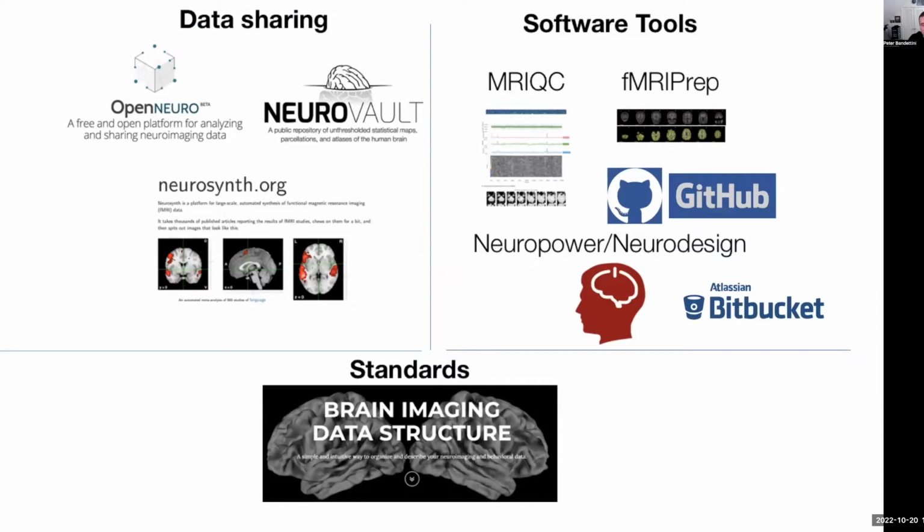Not only is there data sharing, there's tool sharing, and of course there's standards establishment. As methods get developed, there are platforms like AFNI and SPM, and they do get developed and disseminated, which is a good thing. But the field is advancing extremely rapidly. Certain tools may not need to be changed as much, like fMRIPrep, which is a nice pre-processing tool.